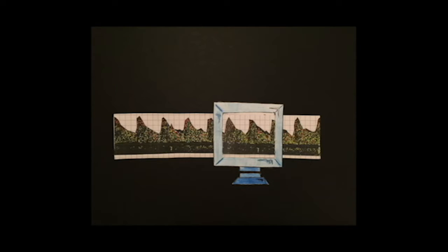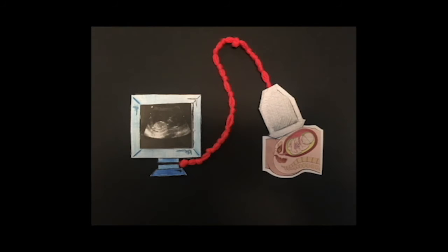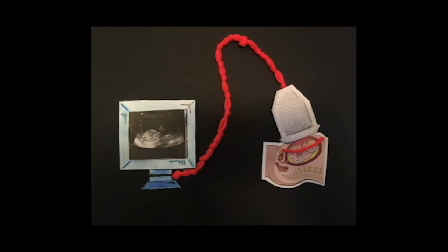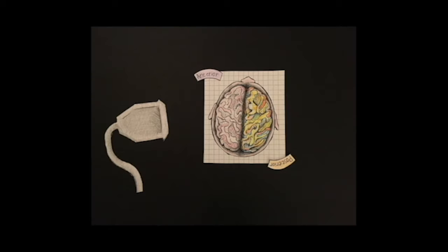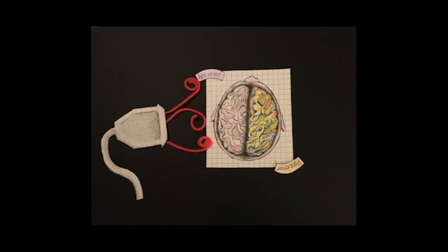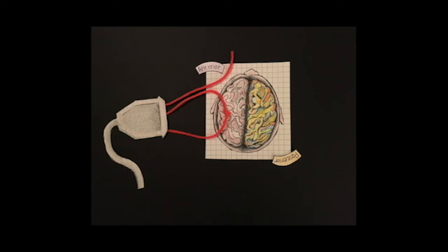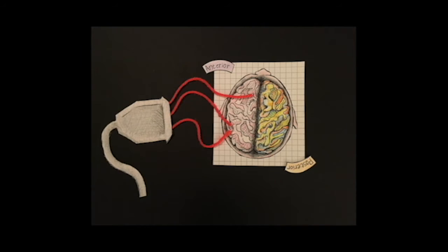Doppler ultrasonography uses two main principles. First, high-frequency sound waves, known as ultrasound technology, penetrate superficial soft tissue but bounce off interior soft tissue like organs. Similar to X-ray imagery, the returning waves can be reconstructed into images. However, unlike with X-ray, the participant is not exposed to ionizing radiation, live imaging can be performed, and ultrasound devices are far cheaper than X-ray devices.